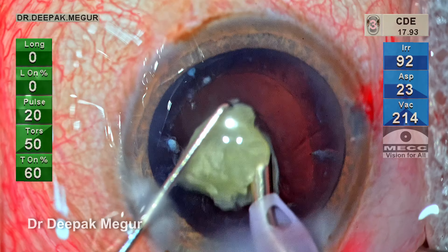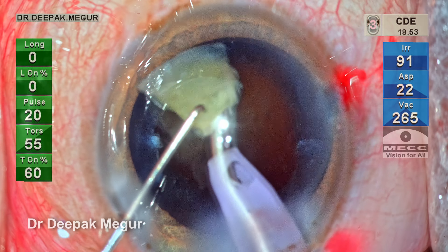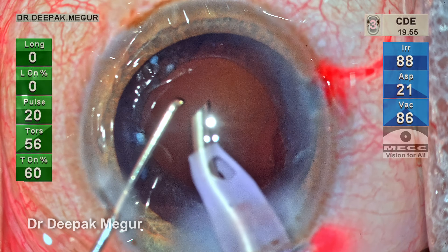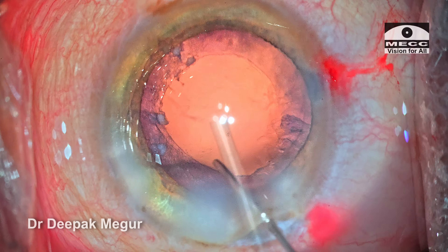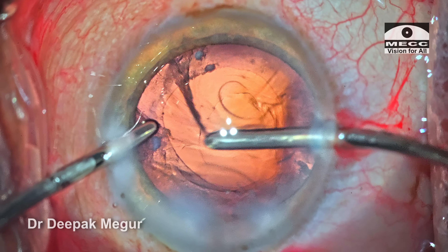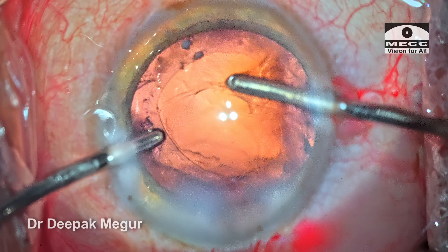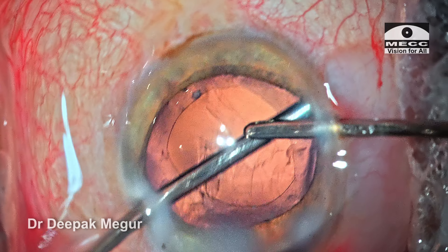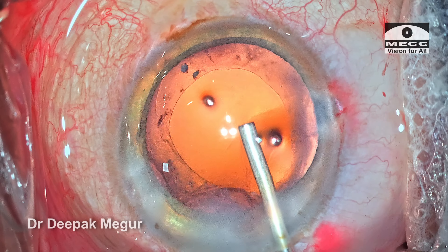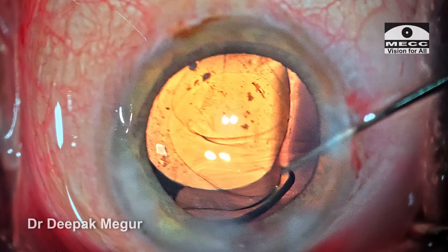This is the last piece, and we can see that the fragment doesn't leave the tip of the phaco — it dances around the phaco tip and eventually gets emulsified. There will be some cortex sticking, and it takes a couple of minutes to remove. Being very gentle and careful, slowly but surely the entire cortex is removed. The bag is then filled with OVD and the originally planned single-piece IOL is placed in the bag.